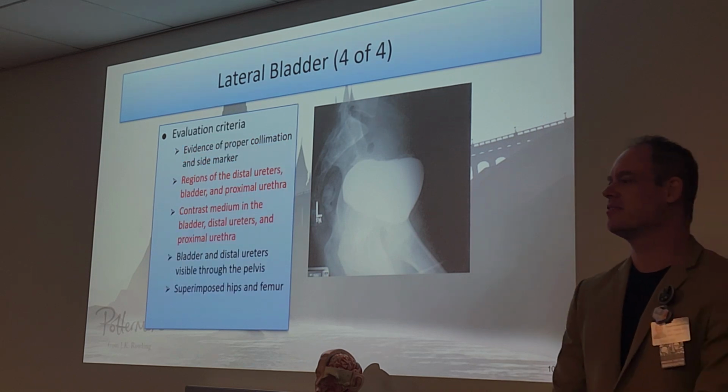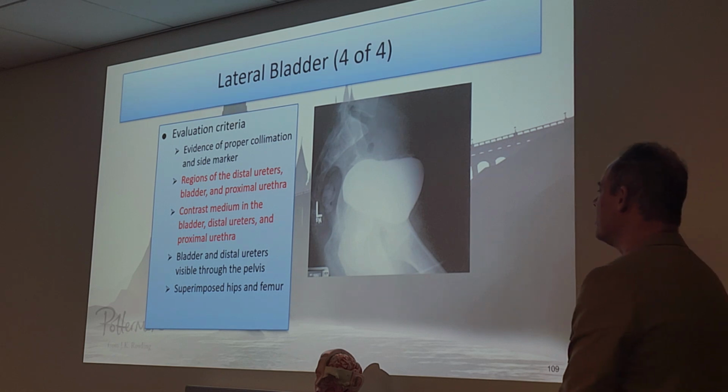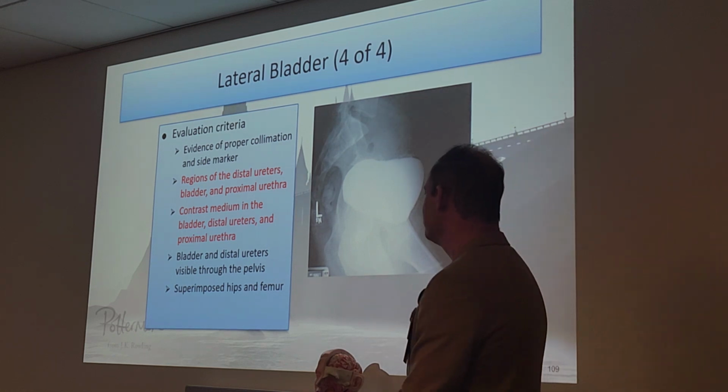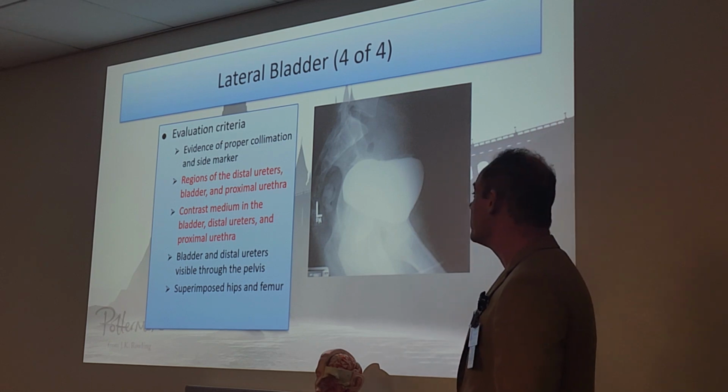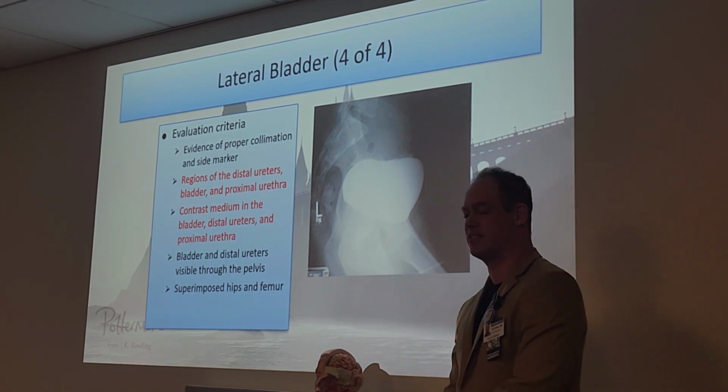Same thing, guys. Eval criteria. Distal ureters, bladder, proximal urethra, contrast in those structures as well. That's a very full bladder, by the way. That person needs to, yeah, that's like maximum.